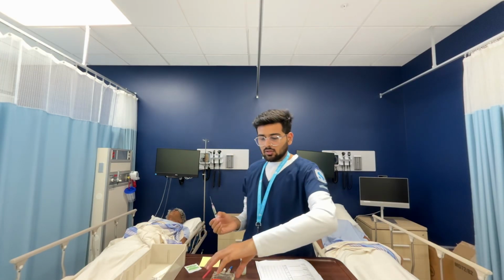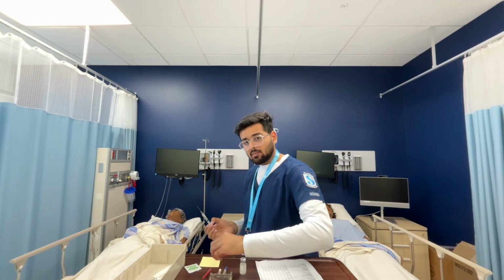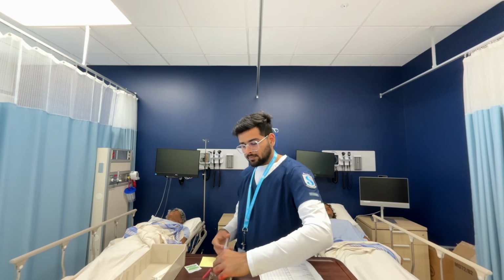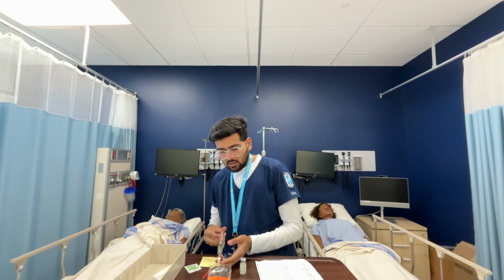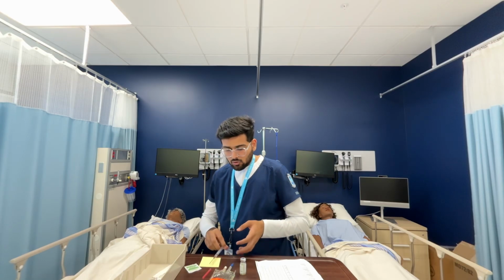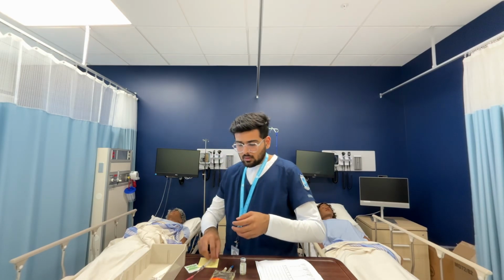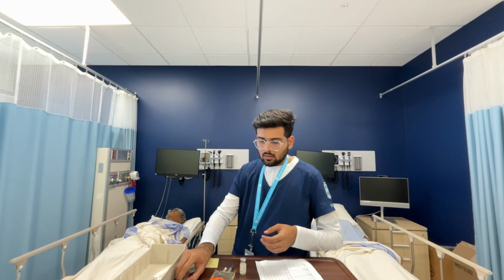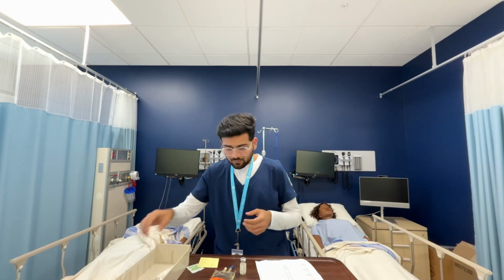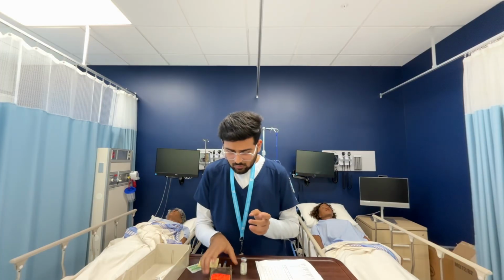Now I'm going to use my piggyback. I'm going to alcohol swab it, let it dry, and then I'm going to inject my medication slowly into my piggyback, and I'm going to use the scooping method. This will go into the sharps bin. Now I'm done with this.